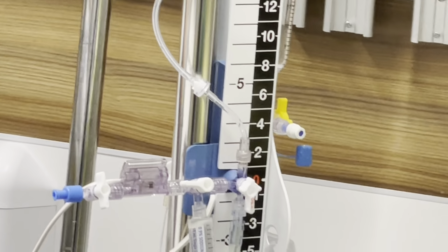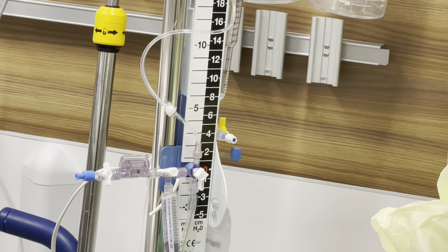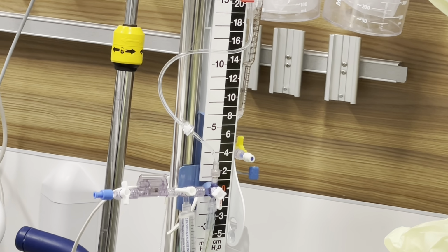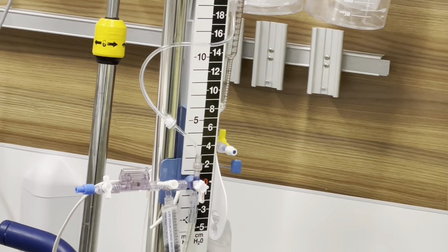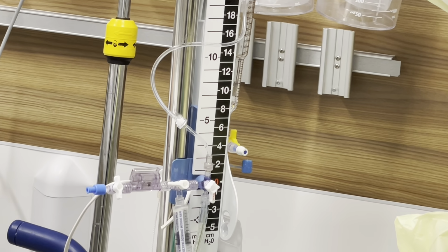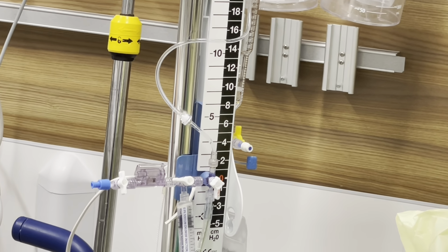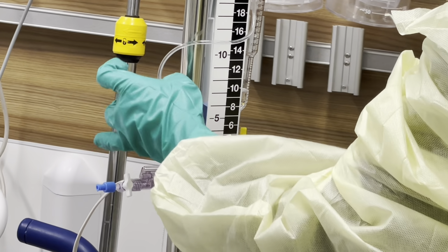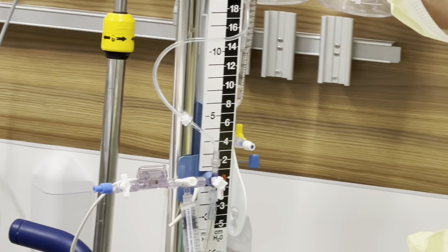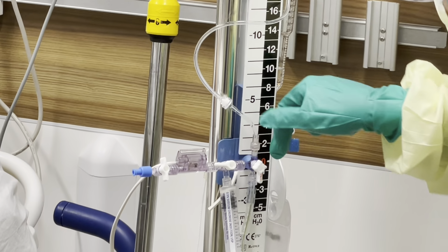So now we're going to go to the drain system, we're going to flush, and you're going to see all the little air bubbles come out, and that's normal. Sometimes you need to pulsate. Sometimes if you have little bubbles in there, you can flick it, or just pulsate. We're going to try to make sure that we get all our little bubbles out. This isn't sterile over here, but we're not really using that hand again. Okay, now we're going to turn it back off.